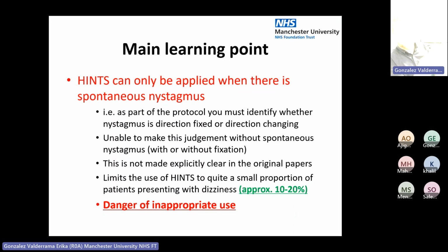But do not worry if you can't remember all this stuff. The main thing is the head impulse. The three most important things in acute dizziness are the history, the head impulse, and maybe the Dix-Hallpike.